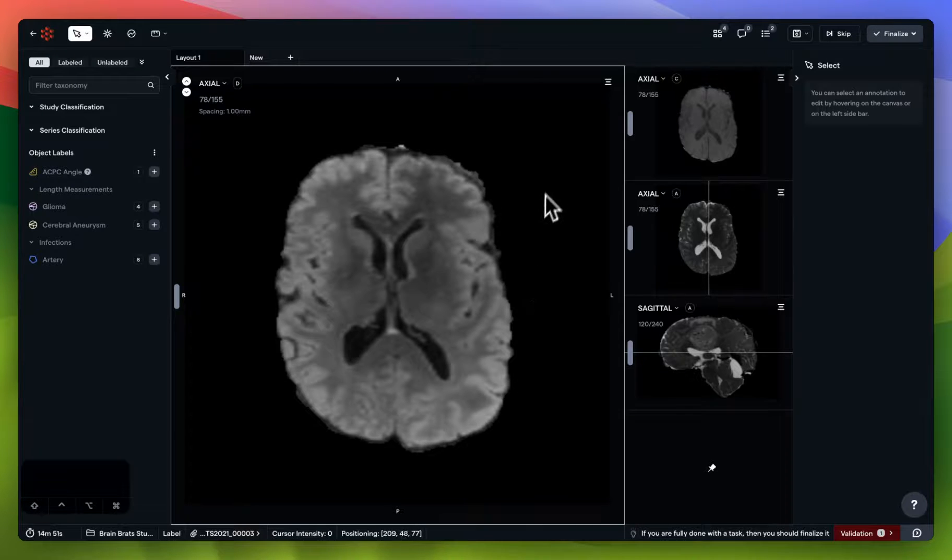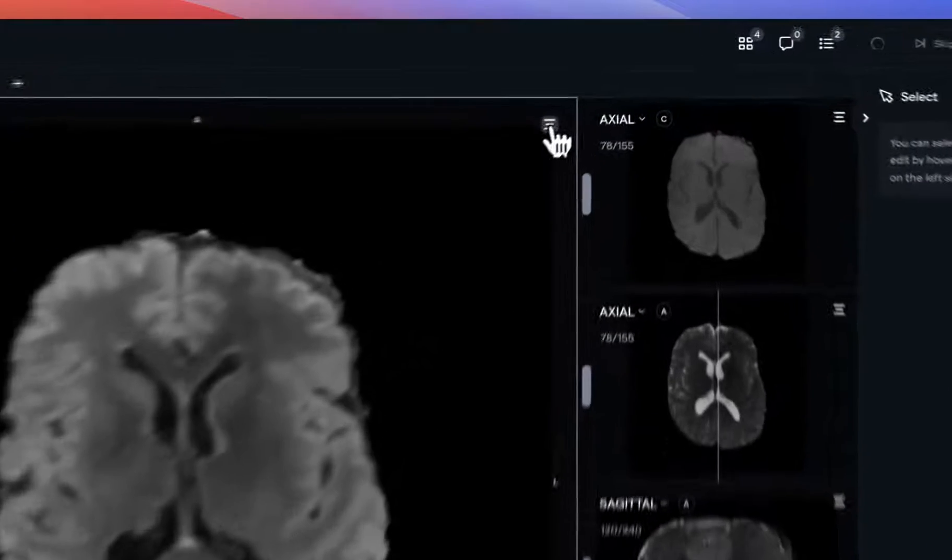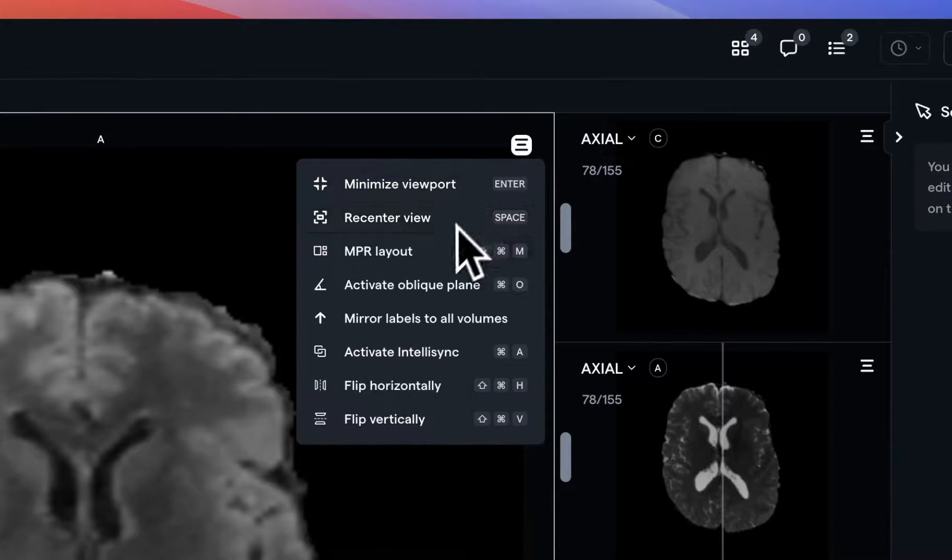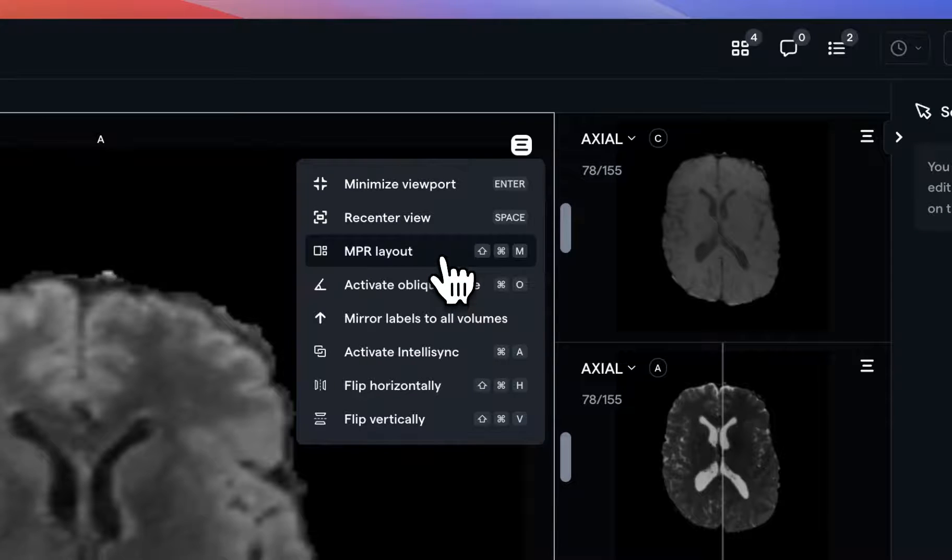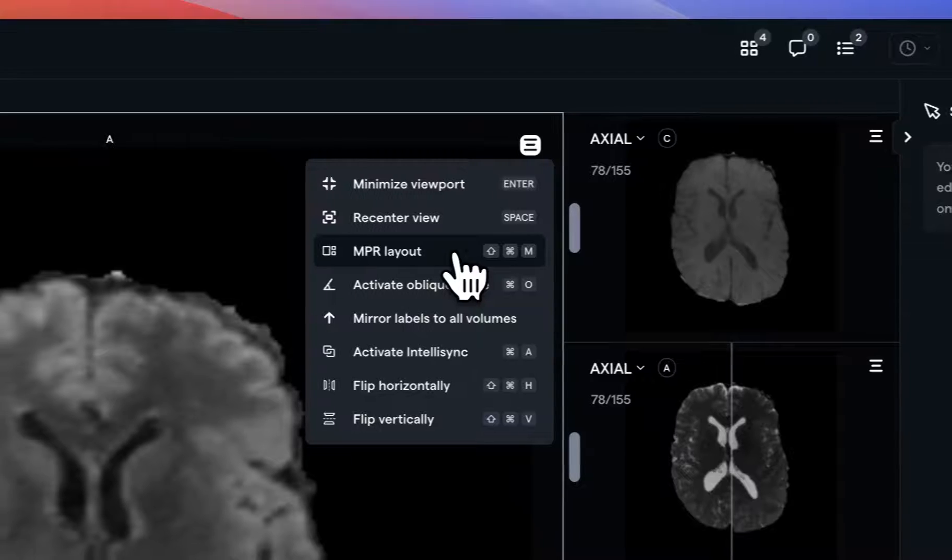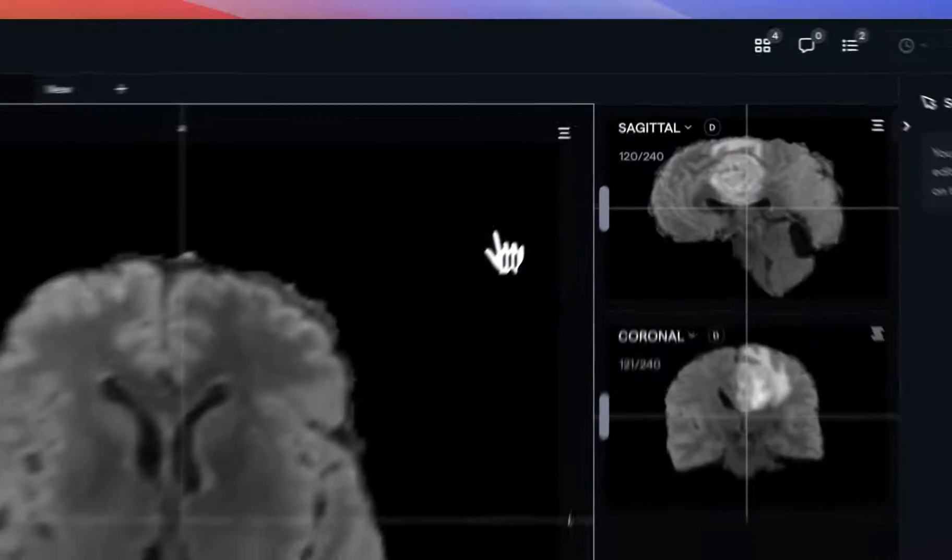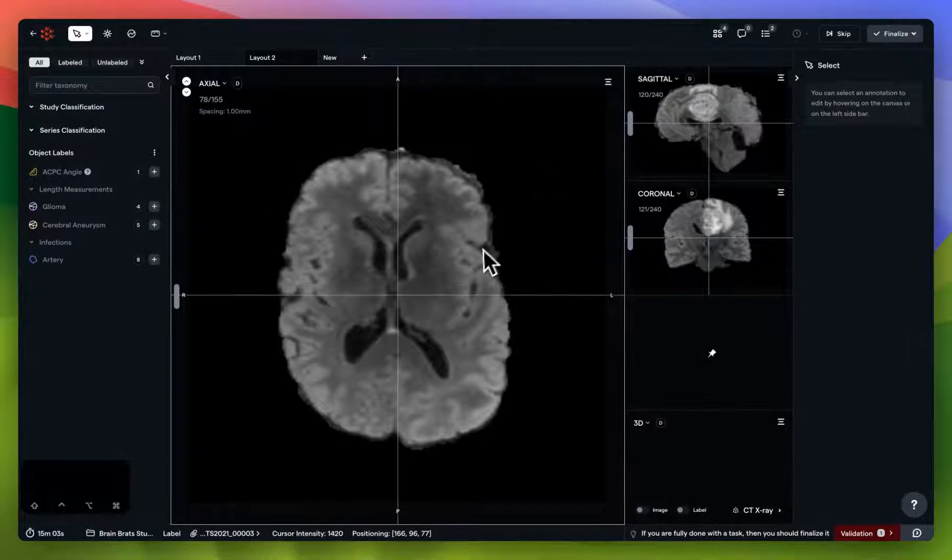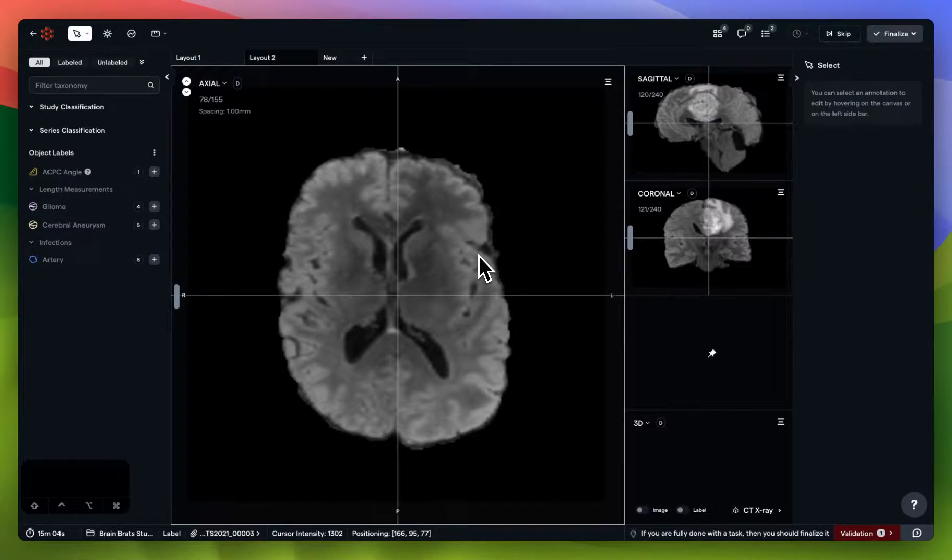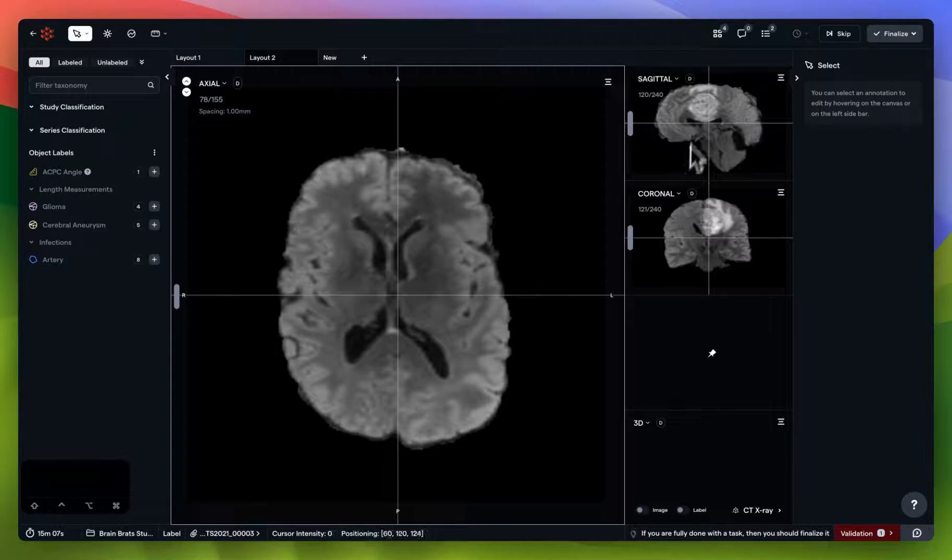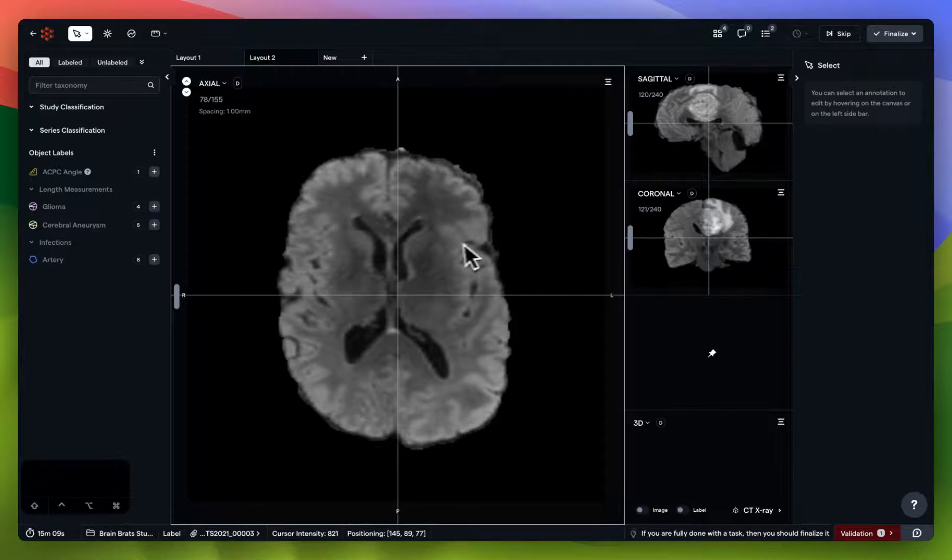Within the hamburger menu of the viewport itself, you also have access to MPR layout. If you'd like to enable multi-planar reconstruction, all you have to do is click here. And you'll see that your series displays in the axial projection, as well as these reconstructions.